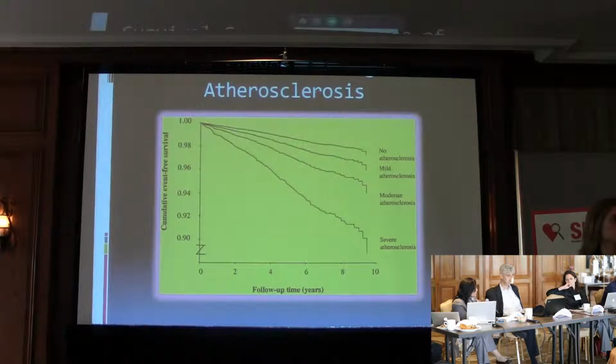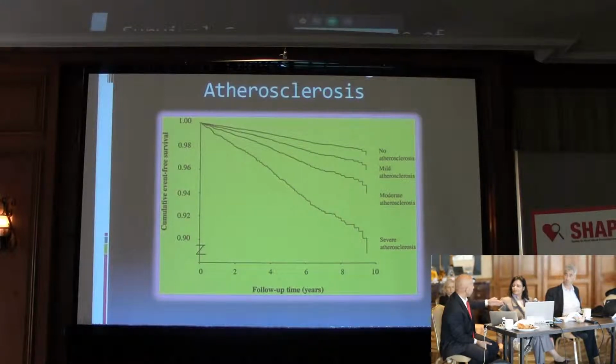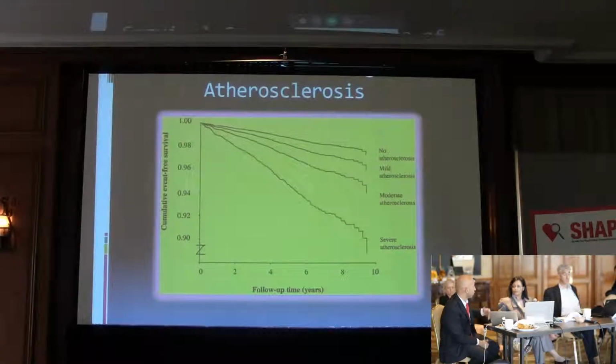So the purpose of evaluating 2 vascular beds is to come up with an atherosclerosis plaque burden that Enrique is going to talk about, which has been compared against corresponding values in CAC, because that's what we have had a significant deficit in the area of ultrasound. Matt, you can look at it like your coronary calcium. You go through 30 slices to cover the entire heart. She's saying this is the equivalent of that. Currently we are doing only 15 slices, just the top. We're going to do the remaining, and then we come up with a scoring method, and the total burden will define it. You can still come up with 40% of those people to be treated. It depends on your cutoff point and where you put your cutoff point.